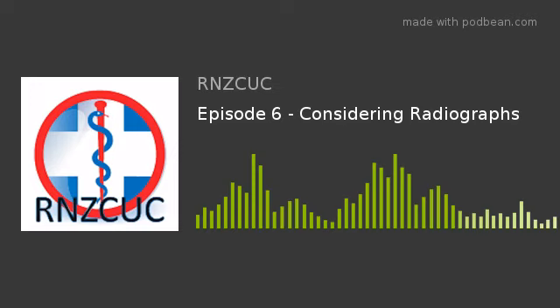I push back routinely when I'm asked to do that, because I think that you can't really interpret it unless you are manually stressing it, which is even more painful. So I tend to say this is a Weber B, it's potentially unstable, there's medial swelling, and I suggest you review the patient.